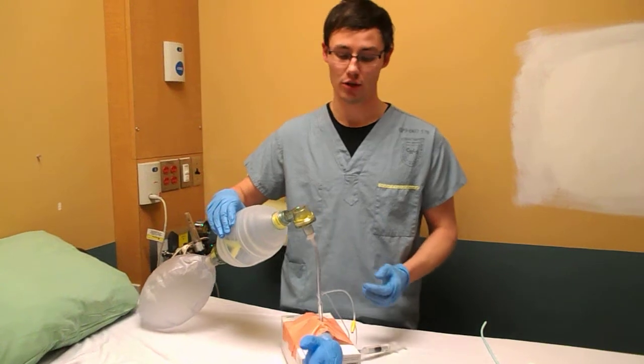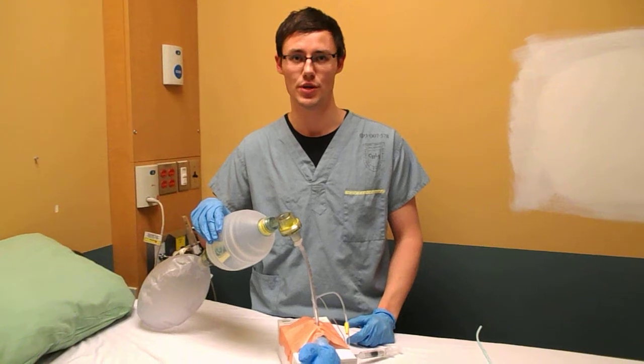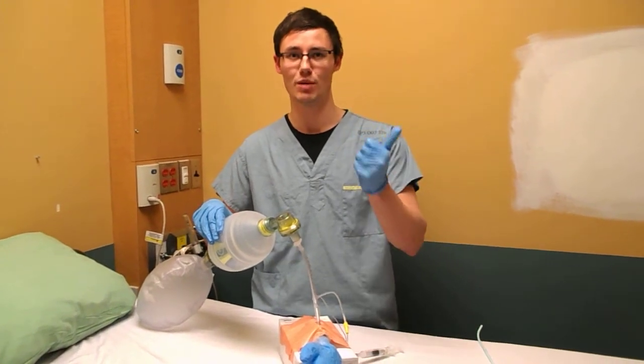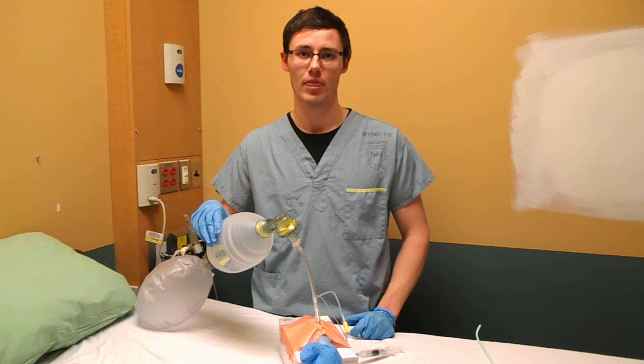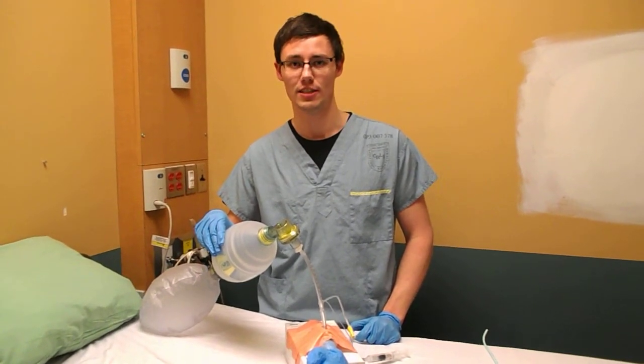Pretty quick. The biggest decision you've got to make when you do the slash trach is the decision to do the slash trach. Otherwise, all you need is a scalpel, a bougie, and a 6.0. Thanks very much for watching. This is Chris Bond from the SockMob blog. Until next time.